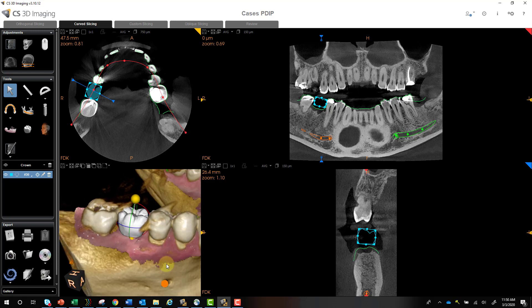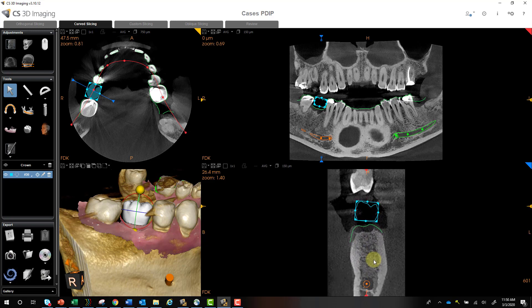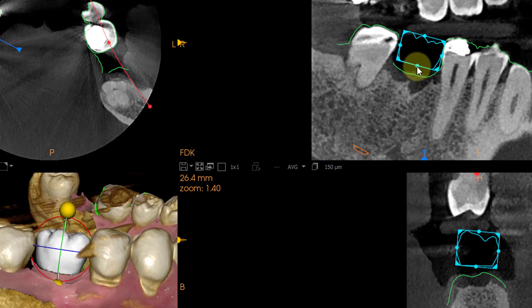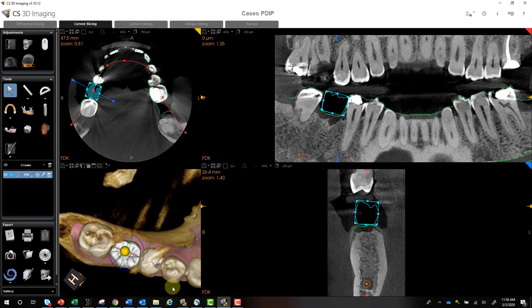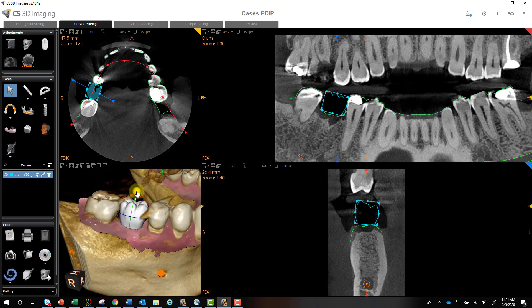If I want to stretch the crown in one dimension — for example, I want to make it longer, bringing it down closer to the gingiva — I would use a movement handle in one of the other views. When I put my mouse on top of this, if you look at the lower left, you can see you're stretching the crown in just that one dimension. I can do the same thing if I want to stretch the crown buccolingually only and not move the other dimensions — grab it here and now I'm stretching it in just that one dimension. So to summarize: yellow nodes move it in all dimensions; grabbing from the other little nodes will move it in that one dimension.